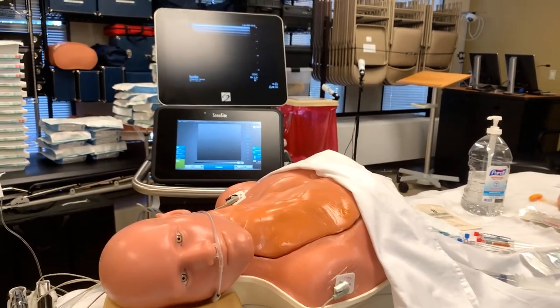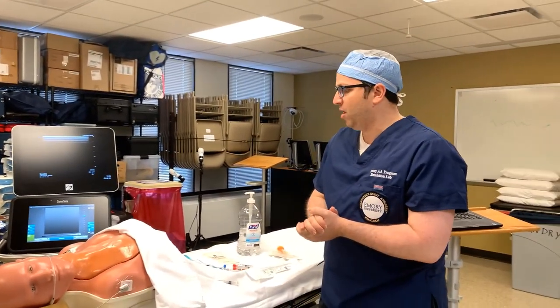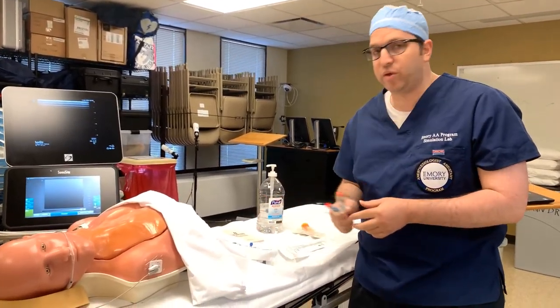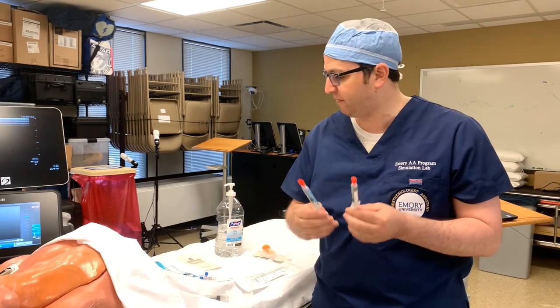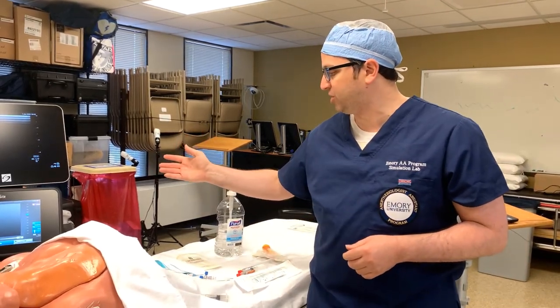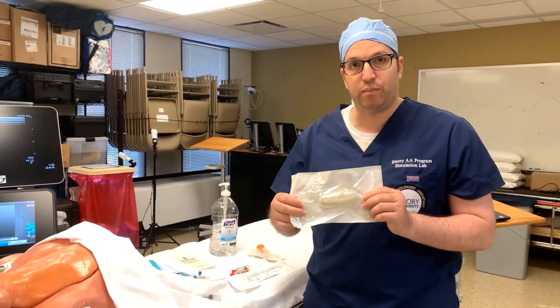While we're allowing for that prep to dry, let me quickly go over the equipment we're going to need. First, notice that the patient is on oxygen and monitors — that's critical because before we do the procedure, we're going to be sedating the patient, so we need to make sure they have oxygen and monitors. I have some fentanyl and Versed available, and we have the ultrasound machine. Along with that, we have a sterile ultrasound probe sheet.